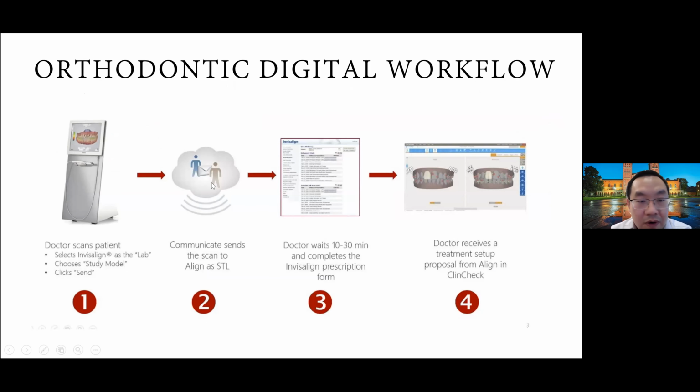Okay, orthodontic workflow. You guys already know Invisalign, right? Traditionally, Invisalign is only attached to iTero, but recently, I think Invisalign is opening up to more scanning software systems. I think Medit, which is a Korean company, is now partnering up with Invisalign, and 3Shape too. So essentially what you do is scan the patient's intraoral conditions and send it to the lab. And then the ClinCheck system, which is part of Invisalign, will figure out the treatment plan for you, all right? And then you just have to approve it and make your own modifications in office.